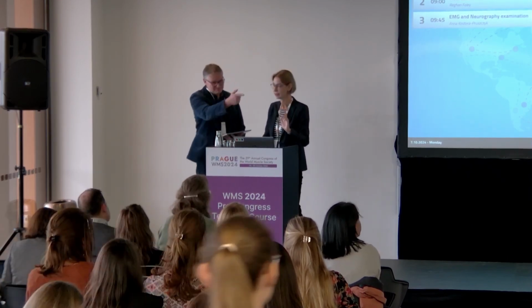May I have a two-sentence comment? Of course, EMG is very important for what we do, mostly for adults, but nowadays in the EMG lab, on the right side of the bed we have the EMG machine, and on the left side, ultrasound. So it's really complementary. It's not just about function, it's also about structure. I fully agree. The new setting in an outpatient clinic should be EMG and ultrasound, so that you have both.